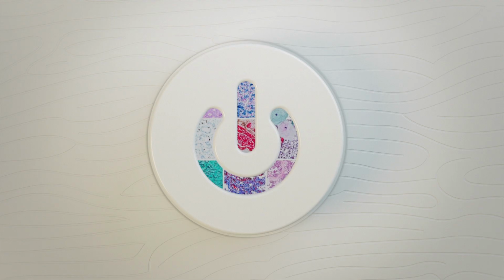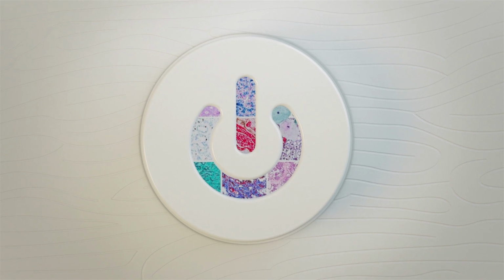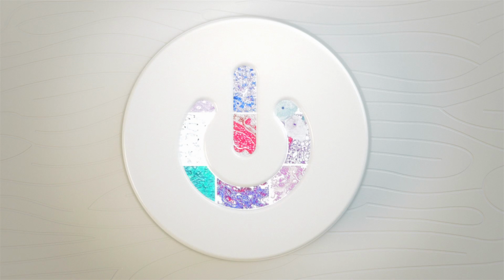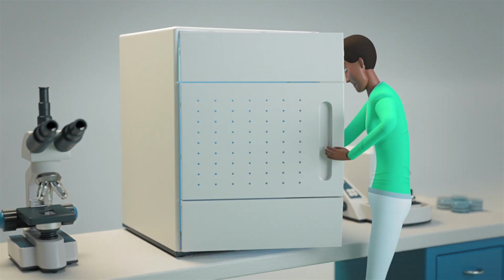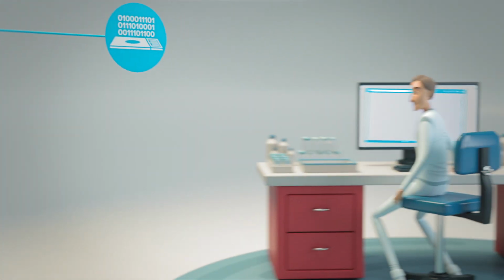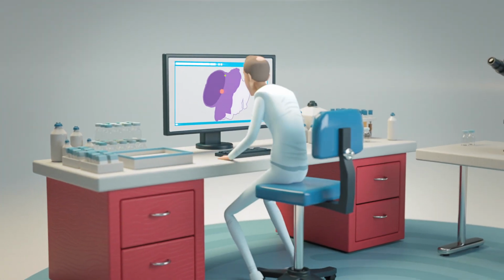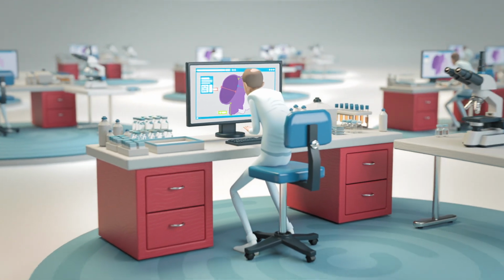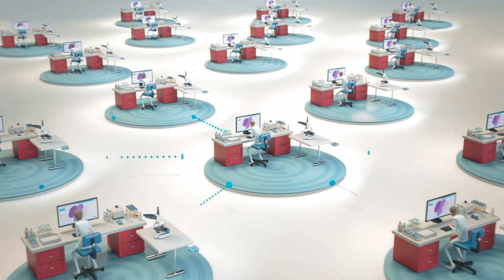Luckily for Steinar, digital pathology has been implemented, simplifying and improving analyses at Norwegian pathology labs. But instead of the pathologist examining the sample in a microscope, the tissue sample is scanned digitally, and the pathologist examines the sample on a screen. This digital sample is instantly available to other pathologists, anywhere and anytime.